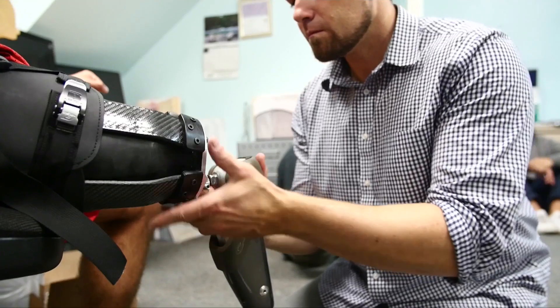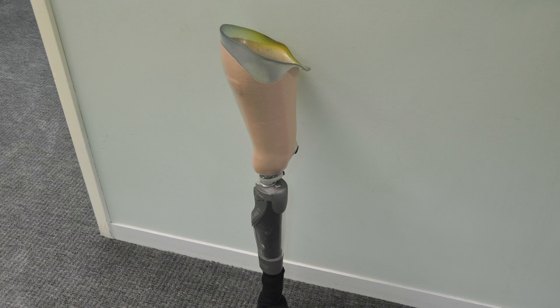The design of prosthetics offers a great parable for innovation today. Consider, for all the invention that surrounded the knee itself — creating new ways of mimicking the way a human knee moves — there's been relatively little attention paid to the socket, which is the molded cup that meets the residual limb.